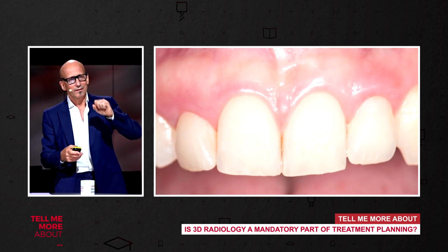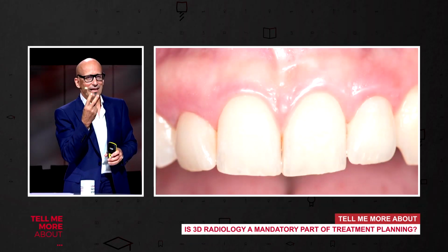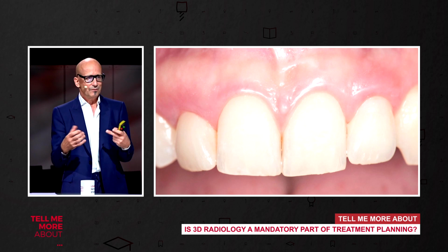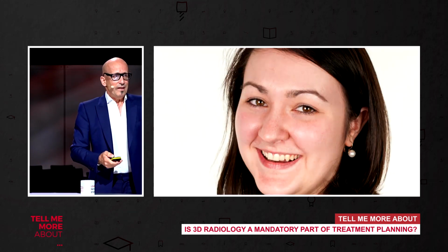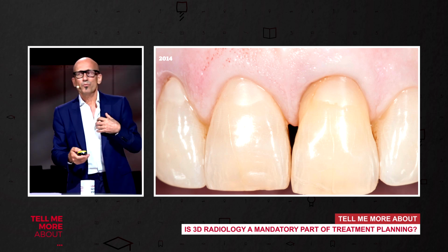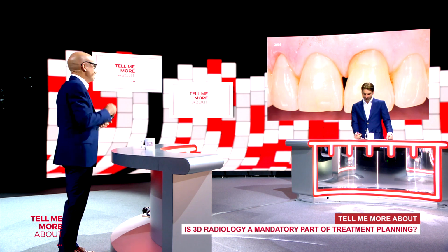This is the second session where the patient shows up, he gets the final crown, and he was in our office twice. And there, I think we have to think about that. There we have possibilities which were opened now all of a sudden with this 3D radiograph, that we can achieve that. Even when we go to implant the aesthetic zone, my personal opinion is we need a 3D analysis before we are going to place an implant there.